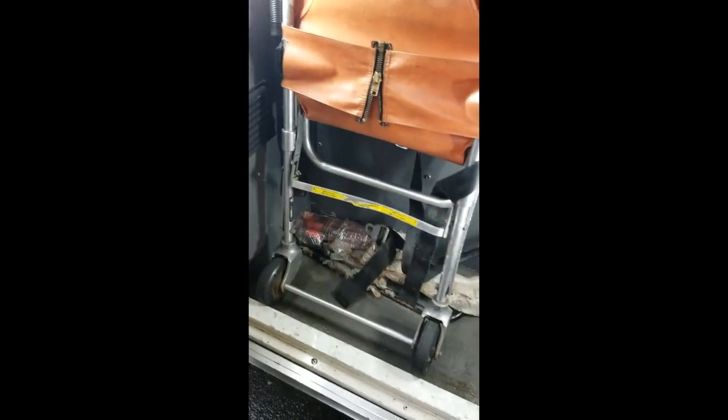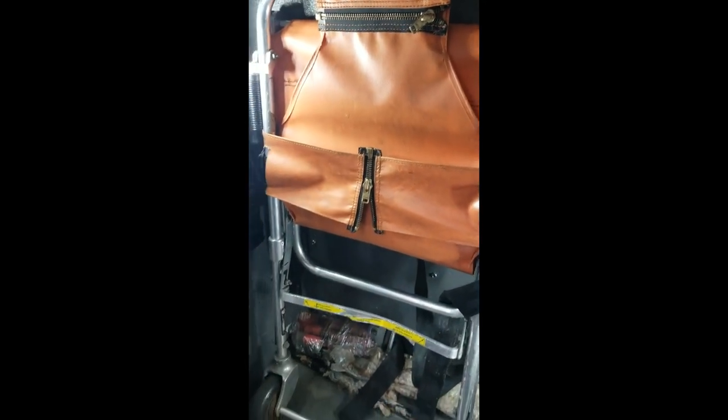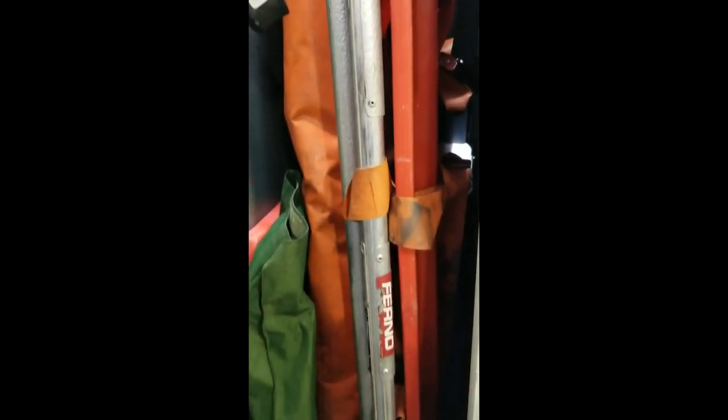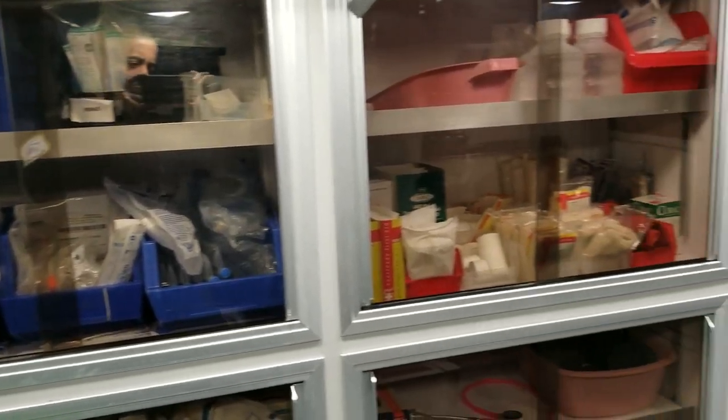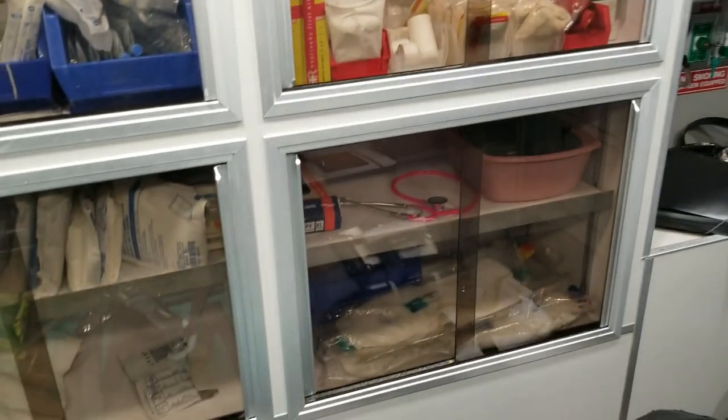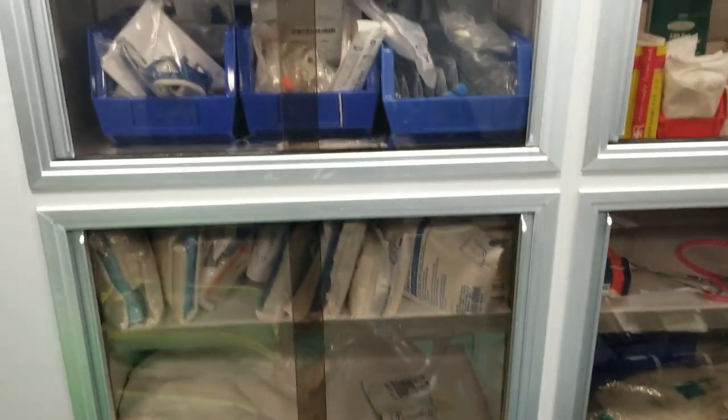Over here we have transport equipment along with flares, a jack, and a stair chair. Over here we have more trauma and mobilization equipment — splints, a short board, a traction splint for adult and pediatric, a scoop stretcher, and a long backboard for mobilization and ease of extrication. Inside the ambulance, everything is organized and segregated based on its purpose.